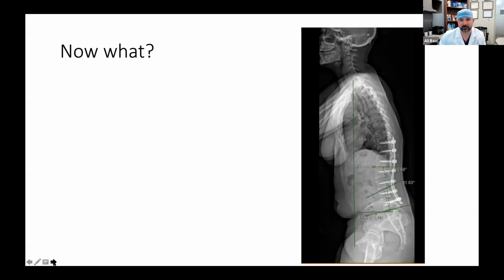Did you go down to L5 or sacrum, Matt? Here I'm stopping at L5. You're at L5, and she's fused down to just L5, just T11? No, she fused through T11 to L5 where I stopped. Yeah. So she's got the L5-S1 disc. Yeah, which is great. I mean, that's great that she has the L5-S1 disc, because you can take advantage of that.